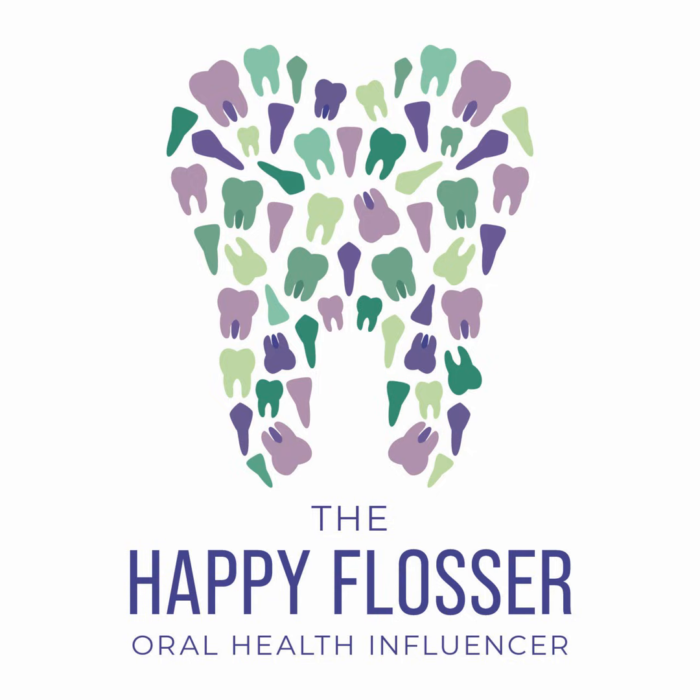For the mandibular canine image, you're still using the blue anterior ring. Place the sensor centered on the embrasure space between that canine and the first premolar. That central ray is positioned between the canine and the first premolar, right in that embrasure space, so that the sensor is vertical and you don't have the cord in the way.